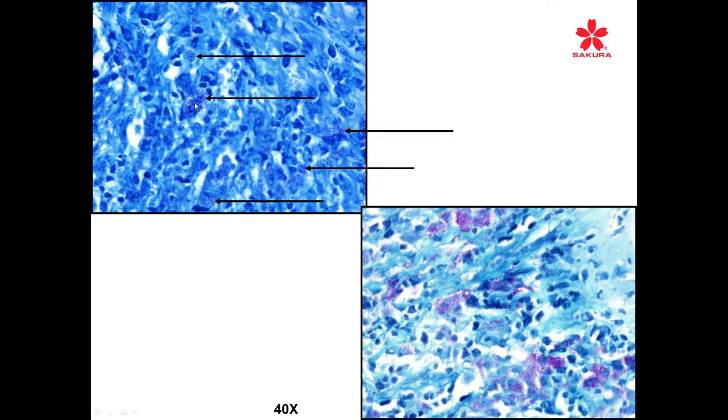You can kind of see morphology, but you can't see color or anything like that. And in a true acid-fast stain, the acid-fast bacteria are the only things that are going to retain the red dye, the carbol fuchsin dye, which here you can't really tell. You can just tell morphologically that there's some type of structures there. Here you can actually see them retaining that dye.